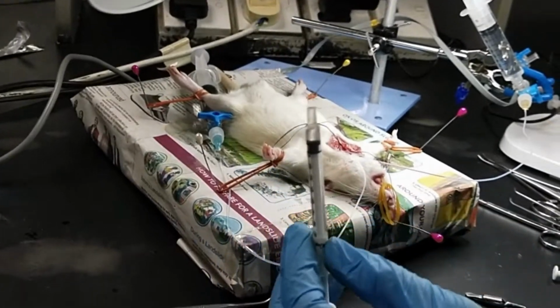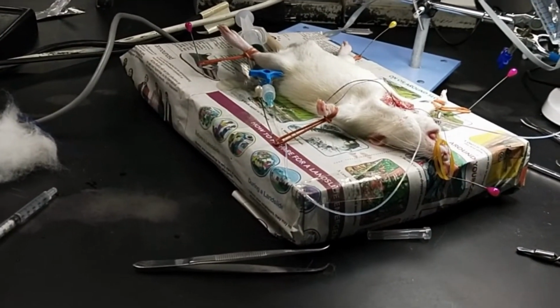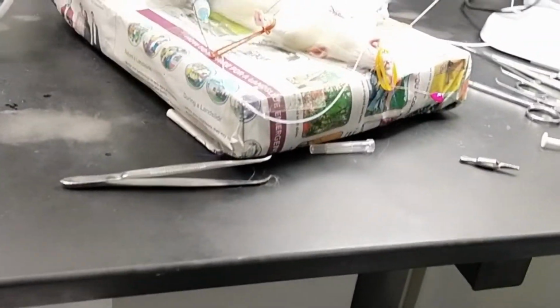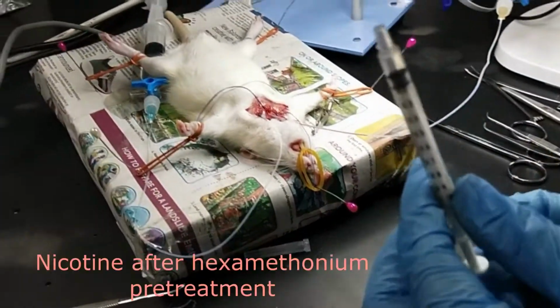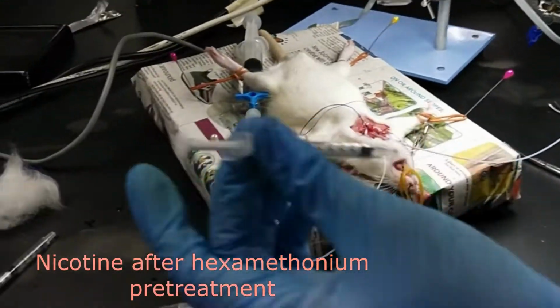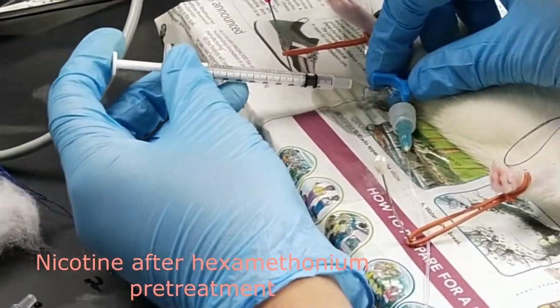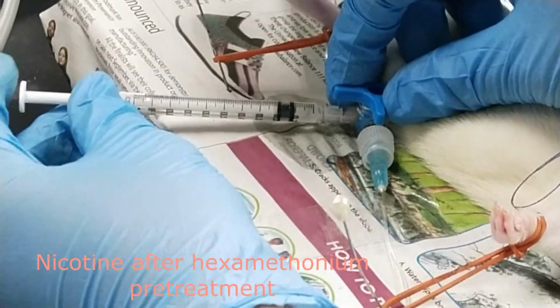So next we're going to proceed with the post-treatment by using the nicotine. So we're going to use the 50 microgram per kg of nicotine to study the effect of nicotine after the injection of hexamethonium. So now we're going to proceed by injecting 0.1 ml of nicotine into the system.